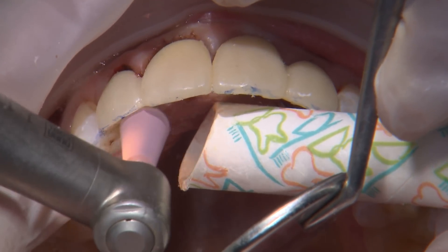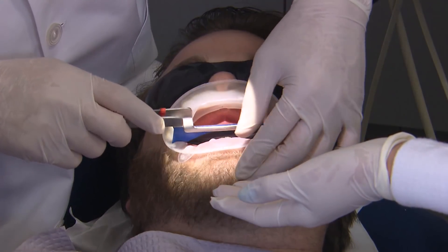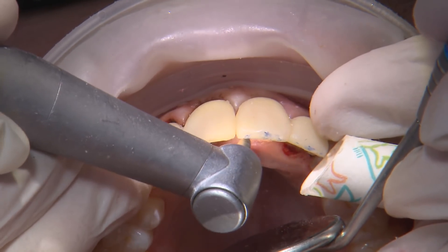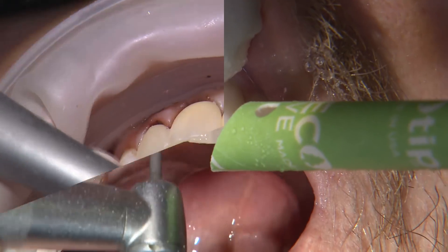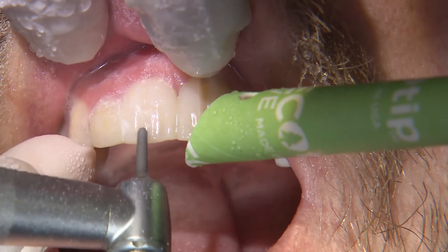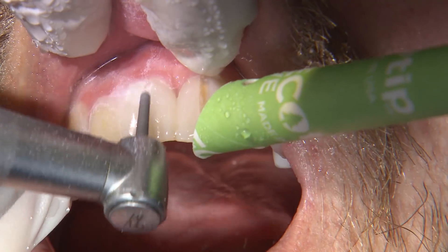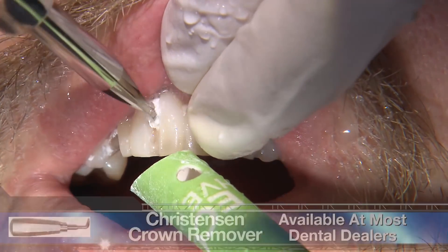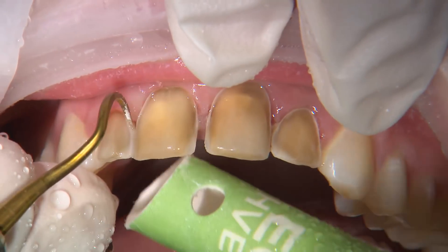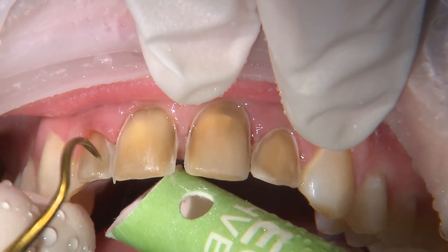After the provisionals are bonded into place, I'm smoothing out the lingual margins with a composite polisher so these areas blend in really well with the tooth surface. I then use a fine diamond football to adjust the high spots on the provisionals while carefully avoiding the tooth structure, which could alter the margin position. When it comes time to removing the temps, I place vertical depth cuts until the acrylic is thin enough where I can see the color of the preps showing through. I avoid cutting entirely through the provisionals with the high speed so I don't inadvertently mutilate the preps beneath. When the material is thin enough, I twist with the Christensen crown removal tool until it breaks the temps apart for quick removal. If there are any areas of composite still on the tooth surface, I recommend using a slow-speed round bur to gently remove the excess.